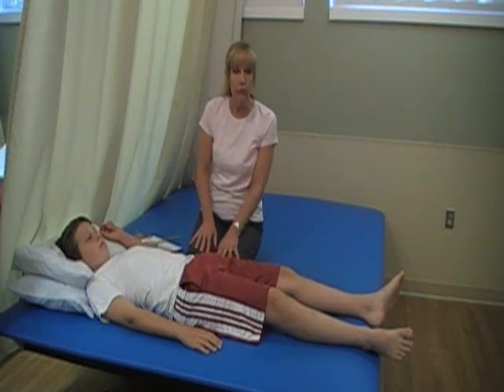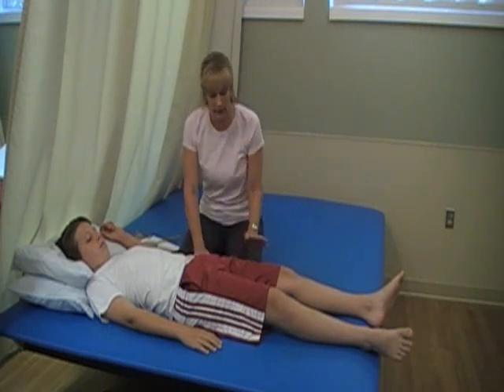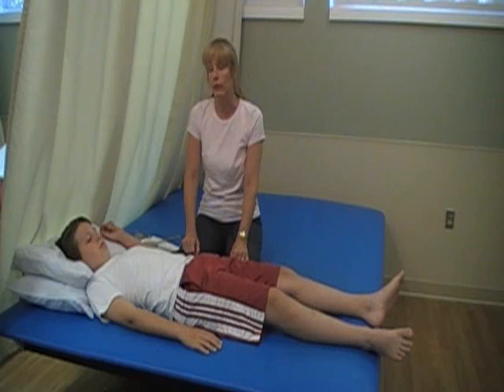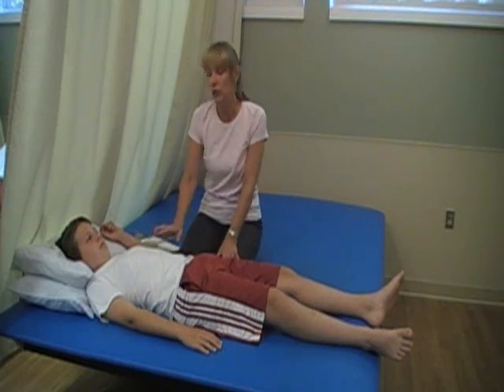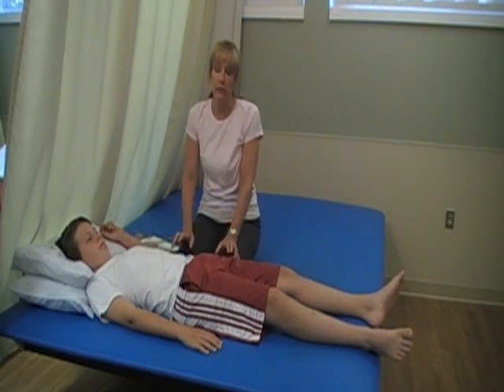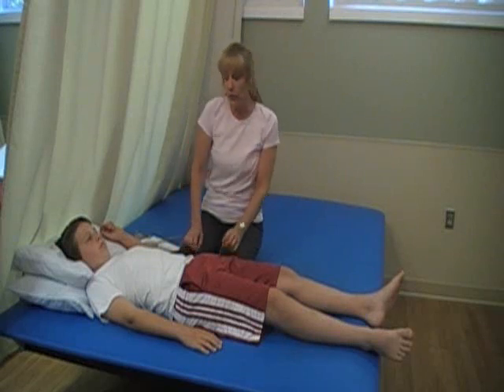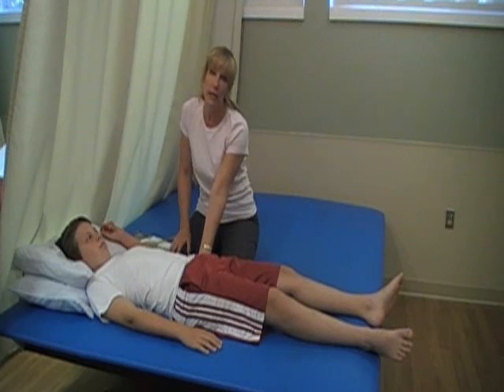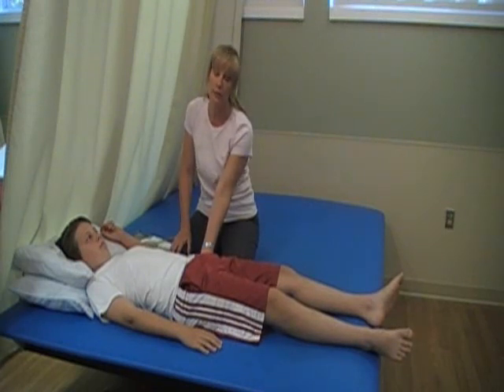In this part of the evaluation, you're going to be assessing the pelvic, spine, lower extremity range of motion and flexibility. You want to also make sure you make a note of their skin status in this position. So when you begin this part of the assessment, you're going to start at the pelvis. The pelvis is the key because it's the base of support in sitting.